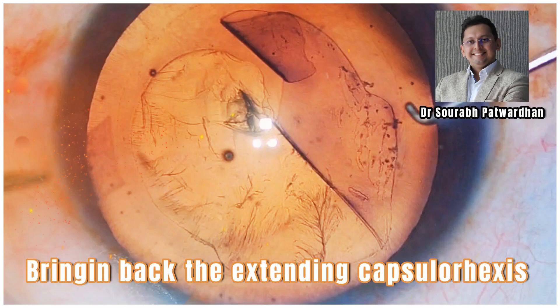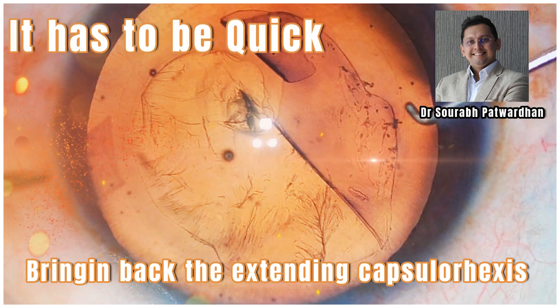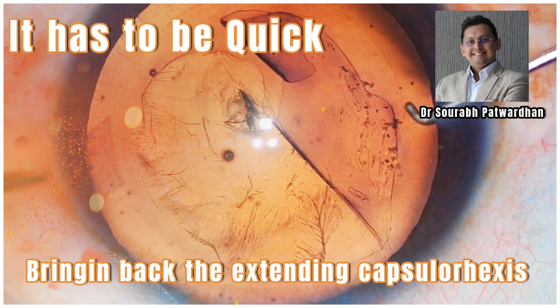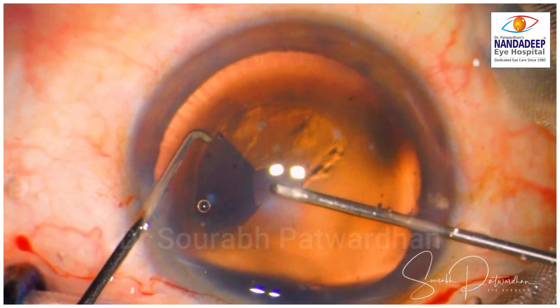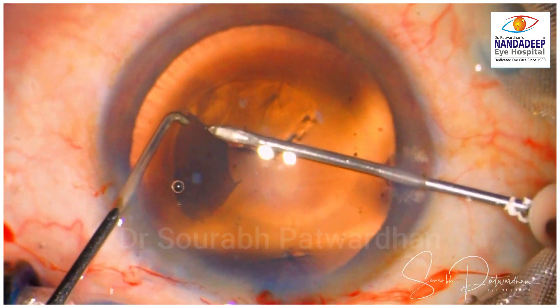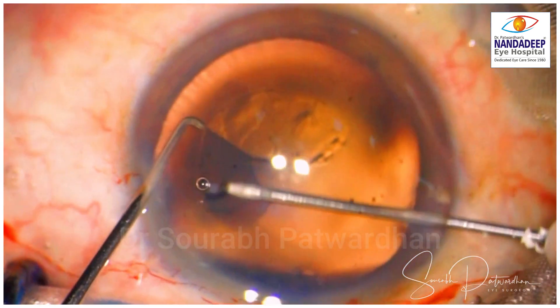In this video, I will be showing a case done by a trainee where the capsulorhexis is extending, and why you have to be quick to pull it back. So just watch this trainee doing the capsulorhexis.